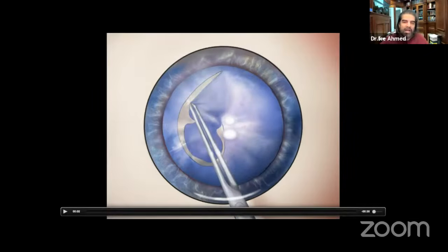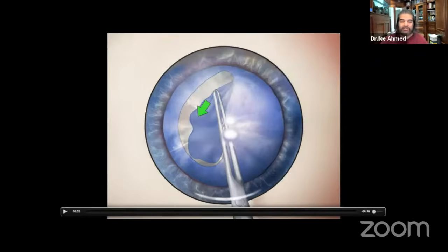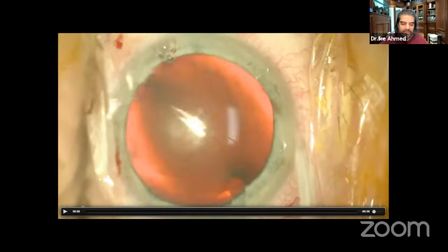And in fact, you can even avoid this if you actually convert to a stretch right away. Unfold the flap completely. Grab the flap about 1.5 millimeters from the apex of the tear, and then pull the flap 90 degrees to the direction you wish it to change. So if you want the direction to change this way, you will pull the flap in a 90-degree direction. So it doesn't mean to the center. It means 90 degrees to the direction we want it to tear. Now the tear has been redirected. We can then fold the flap back and continue along with the capsulorhexis as we should.